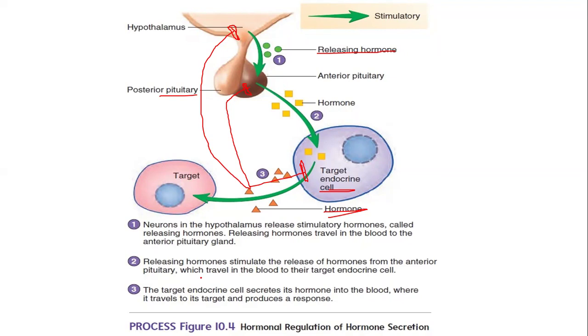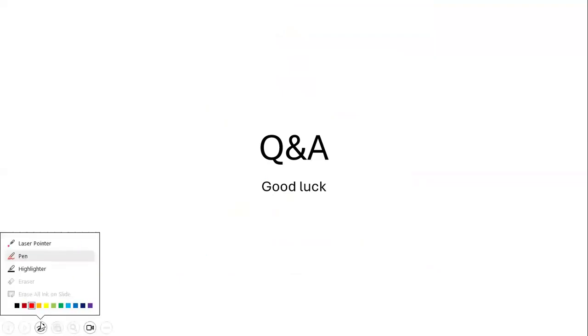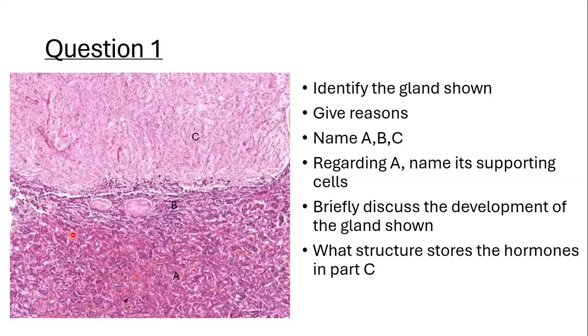With that said, let's now get to the question and answer part. And I just want to wish you good luck. Be keen with these images. Trust me, they are not challenging, but just be keen with them. You just type your answers in the chat box, and I'll be able to see them. So let's start with this one.